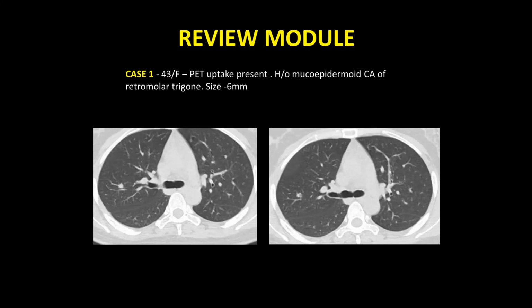There is so much overlap between lung cancer patterns and whether it is a cancer at all. So when it comes to imaging, we are stuck at that level for a very long time. First it has to be proven. Some things are straightforward, like if you see pseudocavitation and all that, we can trace it. But a lot of times it becomes difficult. And extensive ground glass, maybe then we can trace. But a lot of times we will not be able to mention the histological type.